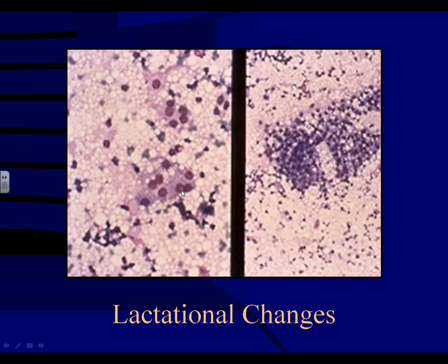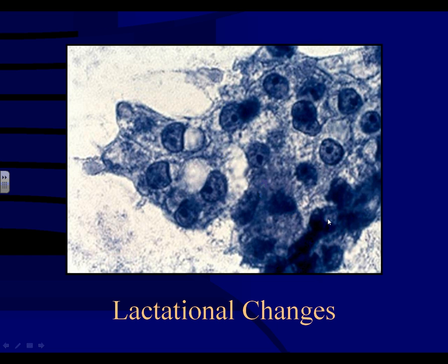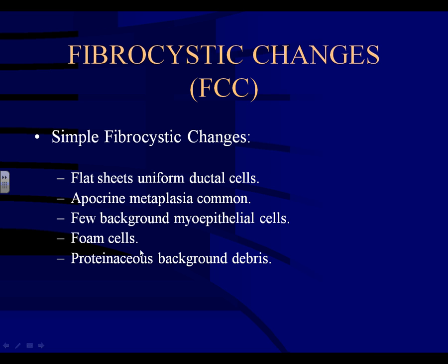More examples of lactational change on PAP stain — notice the granular background from all the secretory material. Groups retain some cohesiveness but the cells have abundant vacuolated cytoplasm and enlarged nuclei, often with prominent nucleoli because these cells are very active. Higher power shows the same: cohesive group of cells with abundant vacuolated cytoplasm, enlarged nuclei with prominent nucleoli — very characteristic features of lactational change.